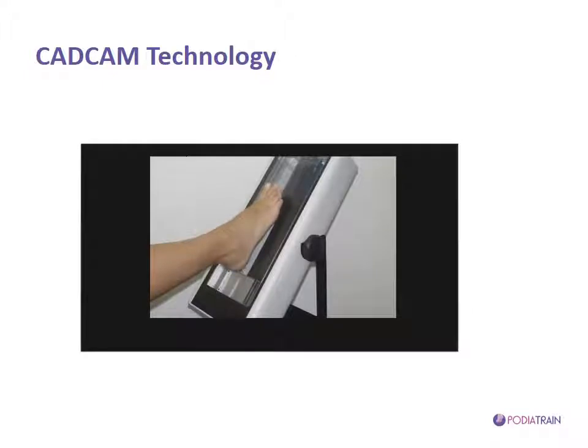CAD/CAM systems allow us to create a virtual object. In this case, we are talking about insoles. So this virtual object will be designed and sometimes even tested on the screen before we actually go to do the physical manufacturing of it.